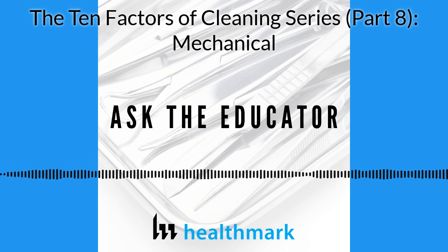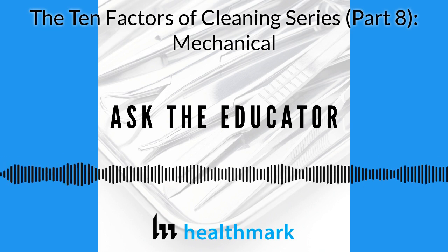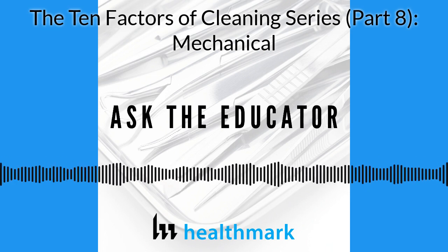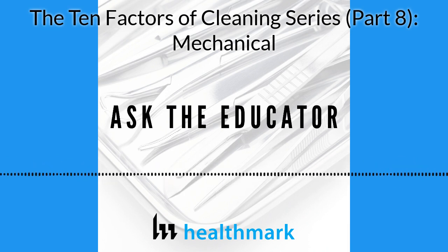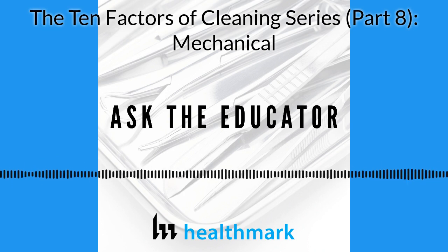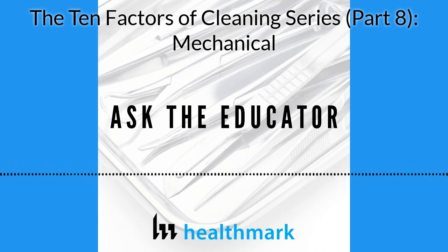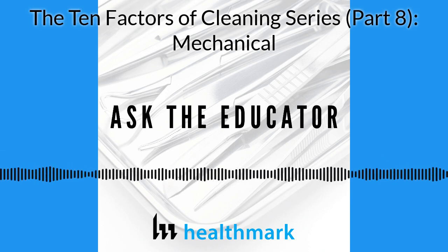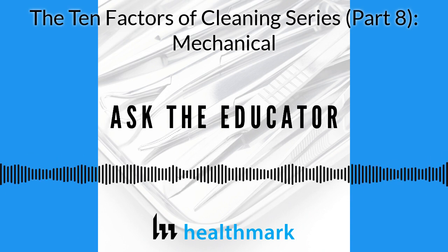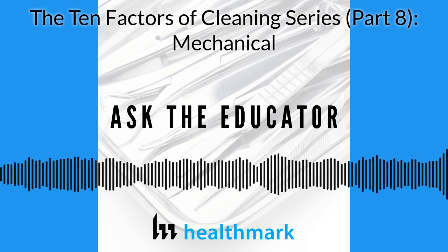When you're cleaning, you pump through, and you've got to make sure those pumps are pushing out the same amount of fluid all the time, too. You start hooking up 5 or 6 items, you hold them up, and instead of getting a big squirt, you get these little things coming. And that might not be enough to clean it for the 1 minute. You might have to increase it to more time. Exactly, it's that exposure time. If the pressure goes down, that's just another factor to consider.